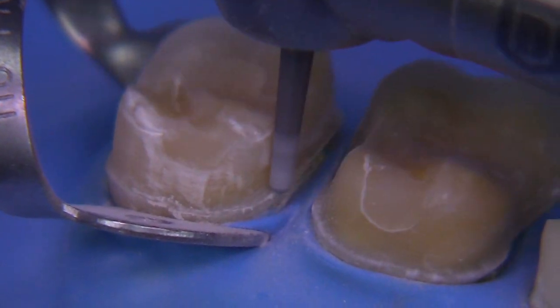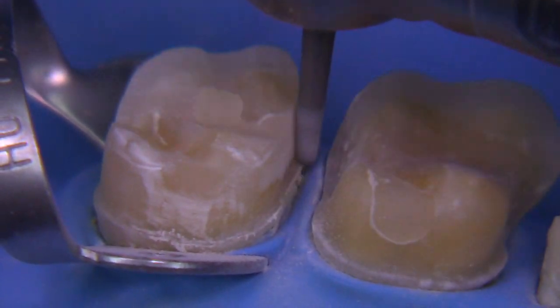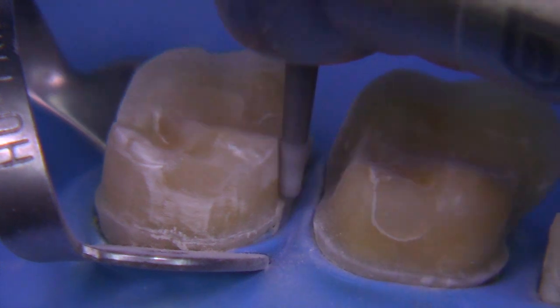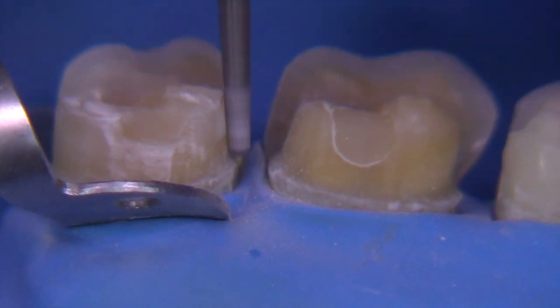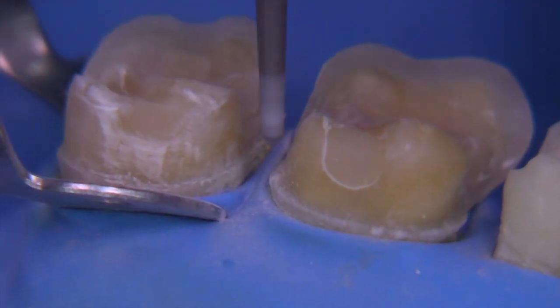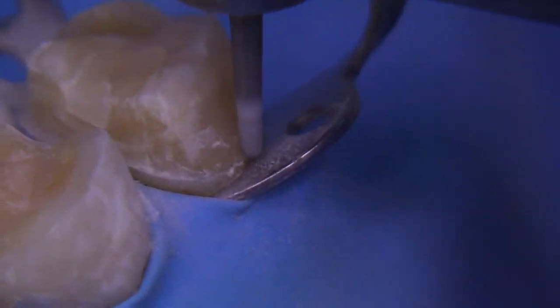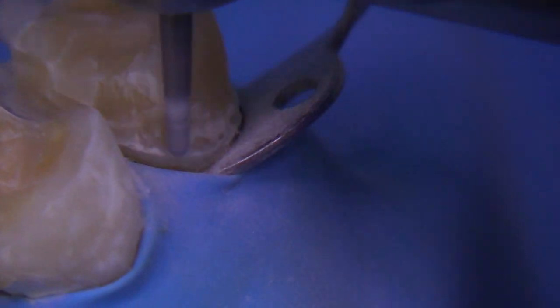You also want to try to round off the sharp edges a little bit — it makes for an easier mill. We don't want the milling machine to over-mill because of a sharp edge, which it can do. When you look on the inside of your zirconia crown that comes back from the lab, take a look and see if there are any little circular marks inside — that's an indication of the need to over-mill to accommodate a sharp edge.